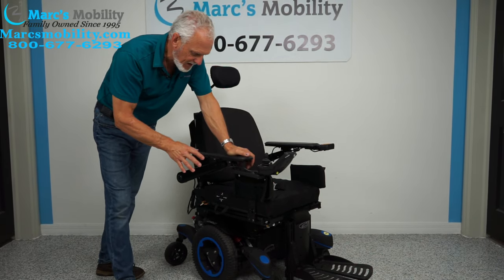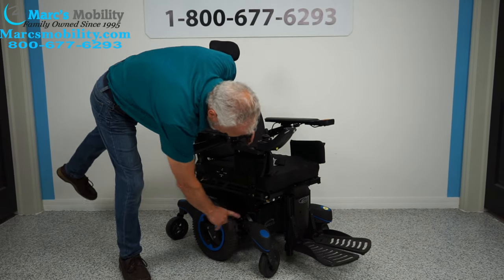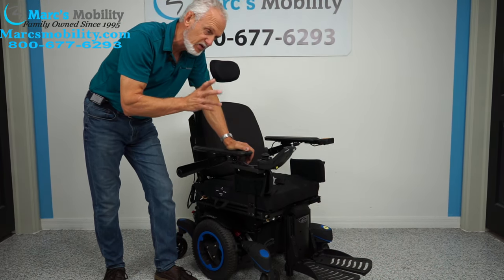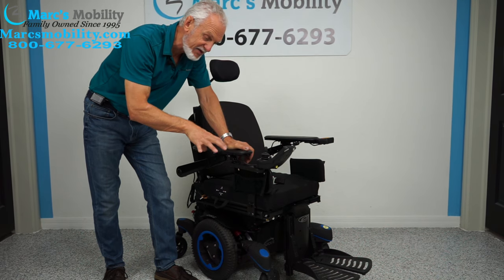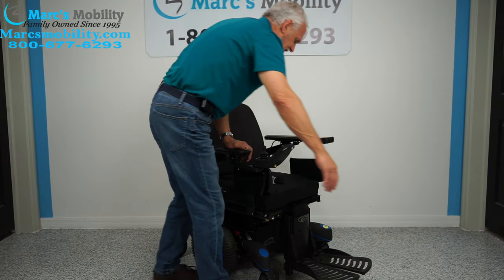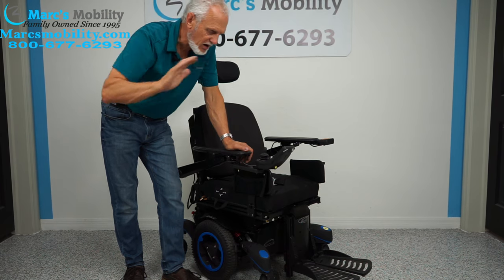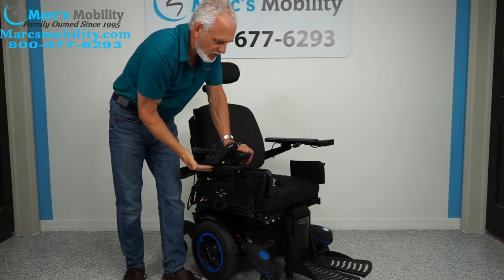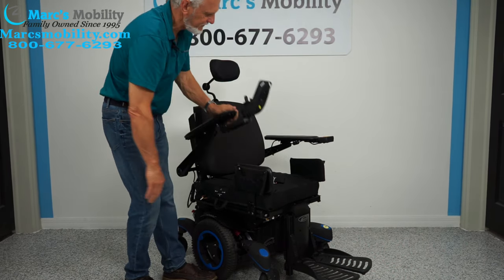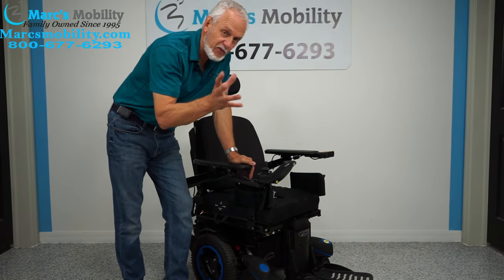Let's recap: this is the Quickie 700M — M for mid-wheel drive. It has spider track suspension with red shocks visible at the front and shocks all around. It weighs over 425 pounds, giving it a great ride. Features include extra-large footplates with side guards, a 12-inch seat lift, electric tilt, electric recline, electric feet, swing-away joystick, lateral knee pads, safety belt, air cushion, and adjustable headrest. It has 107 miles — about five months of use.